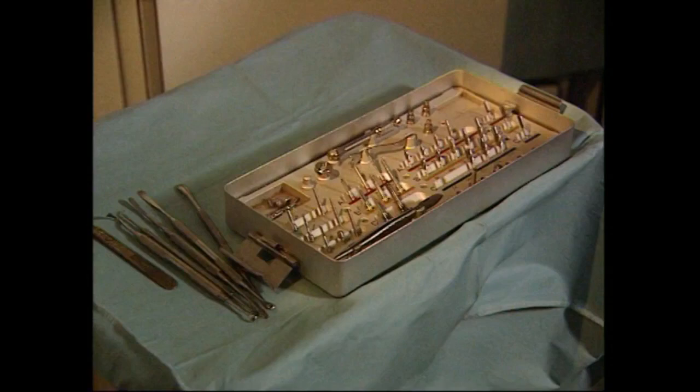The implant insertion kit is now opened and the surgery can now begin in an aseptic environment. Establishing an aseptic area with an effective barrier between the sterile and non-sterile greatly facilitates surgery under ideal conditions. The operator and surgical assistant can freely work together in the sterile zone while the roving assistant remains outside, passing only instruments that are sterile across the barrier without contaminating the sterile zone. Surgery can therefore be safely performed in the proper aseptic environment.